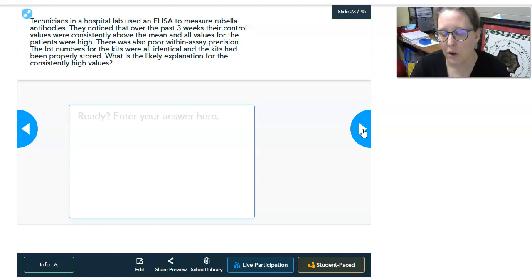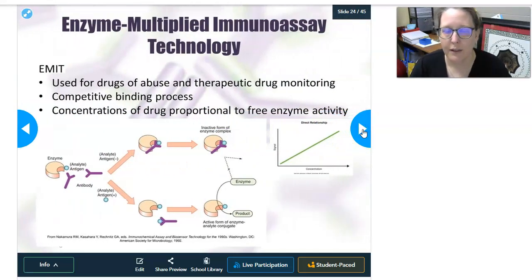So think about all the steps involved in the ELISA and put a possible answer there. And we'll discuss it in class. And if you want the answer from me, you can either ask a question on the video, or if you're in class, just ask me during lab.